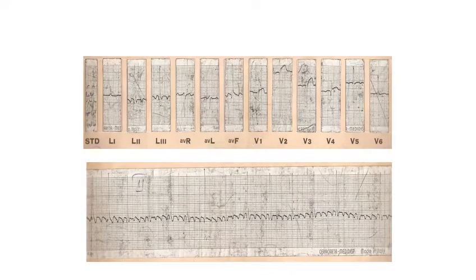An atypical flutter? Sir, I think they are positive waves in 2, 3, aVF. That is atypical. No, the flutter waves can be positive or negative in 2, 3, aVF in typical flutter. That depends upon whether it is a clockwise or anti-clockwise conduction. But what is atypical flutter?